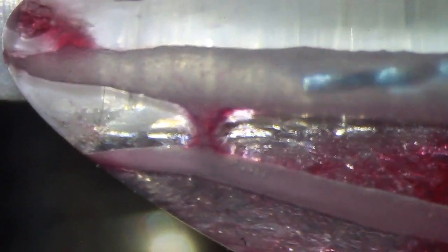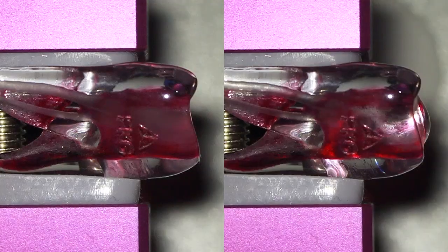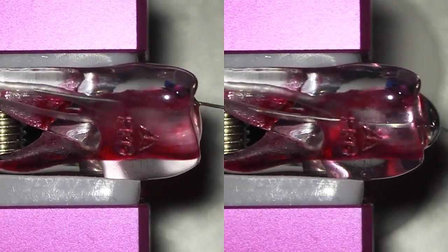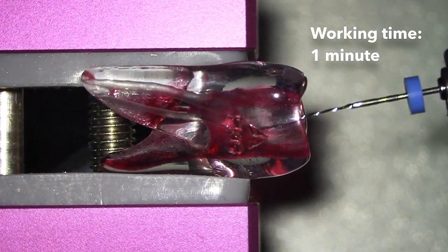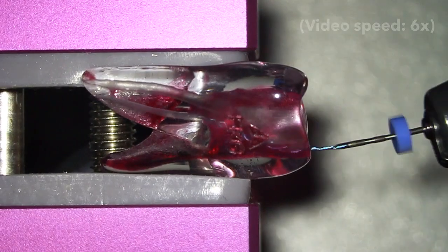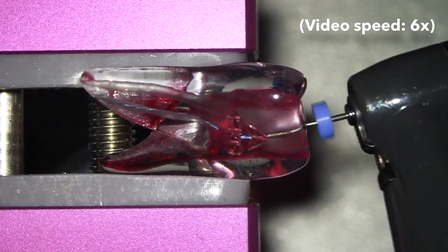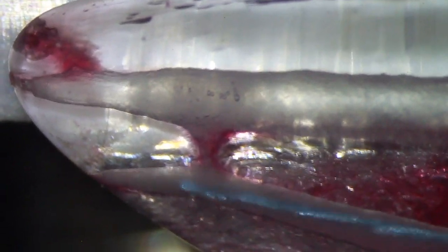Notice fluid movement in the second canal thanks to cleansing of the isthmus. Irrigate both canals to remove debris. And the same in the second canal — notice fluid movement in the canal that connects via the isthmus.